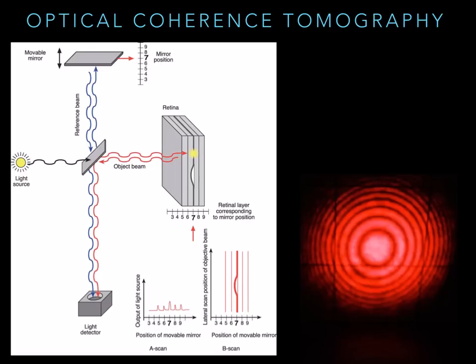With spectral domain, it's kind of like you throw up your hands in the air. It's Fourier transformations, and nobody understands. By the time you understand that, you've forgotten the first 5 steps of how you understood it, and you just can't actually explain it to anybody.